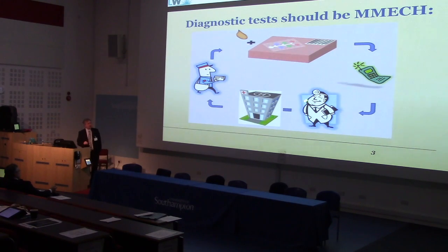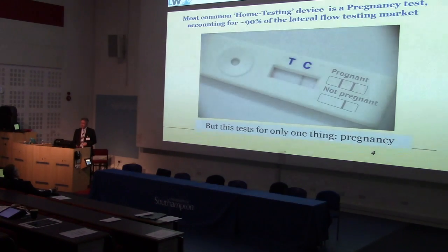So your friendly doctor reads them, gives you a phone call from the hospital, and then the post person here can then come and give you another sample again, which you can use to test with a liquid, often urine, and maybe things like saliva, etc. So that's the kind of schematic of what we think of as a home-based test.